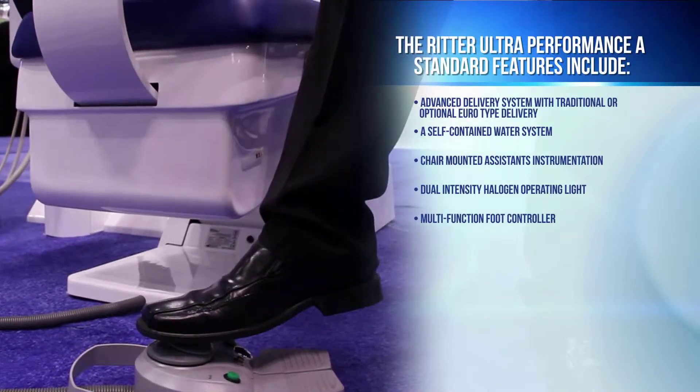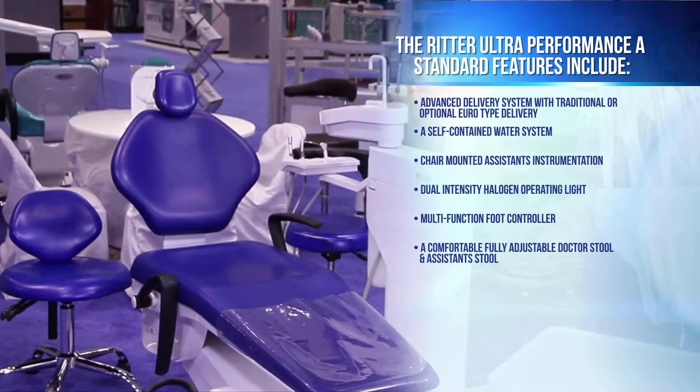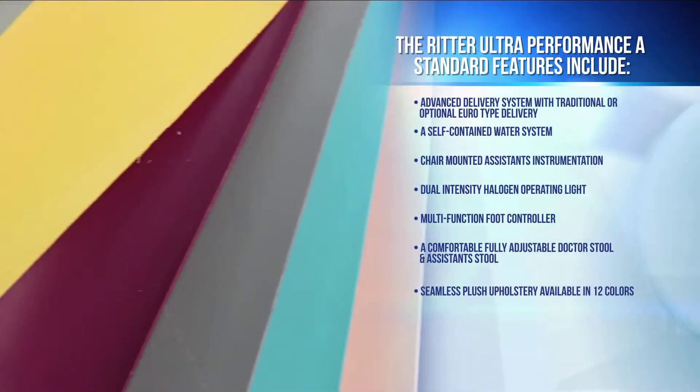Additional standard features include a multifunction foot controller, a comfortable and fully adjustable upgraded doctor's stool and assistant stool, and seamless plush upholstery available in 12 colors.